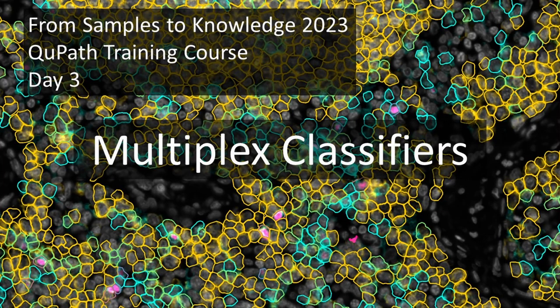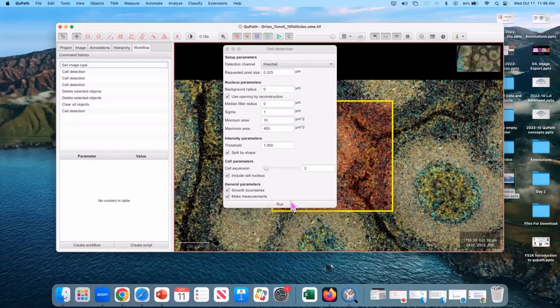What we're doing here is multiplex classification. Fundamentally, if you've got an immunofluorescence image with a bunch of channels, how do you find your single-level triple positives?